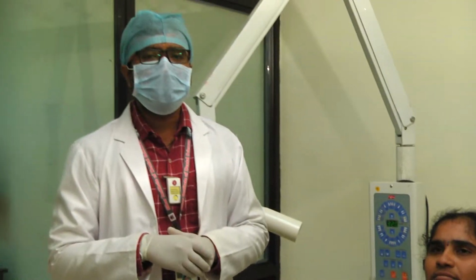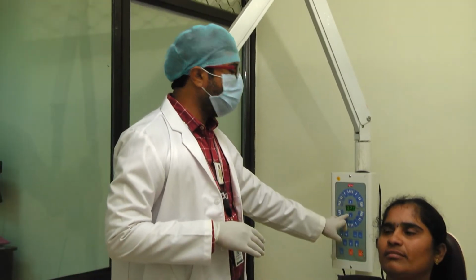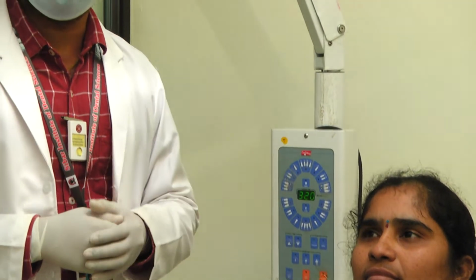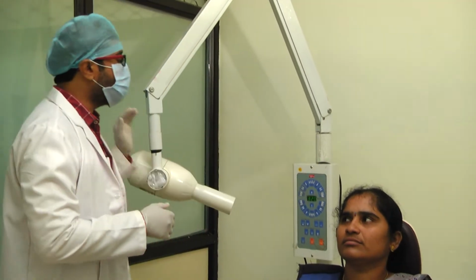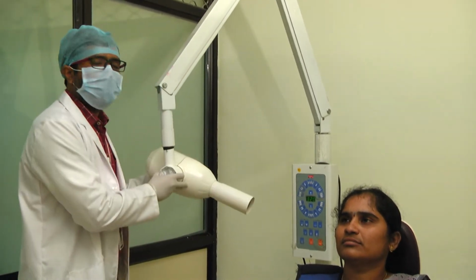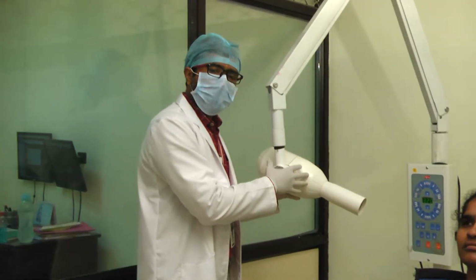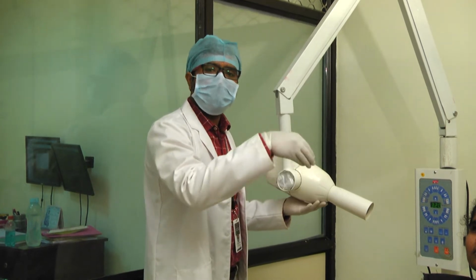The second is to set the X-ray machine settings, that is the kVp, mA and exposure parameters, as per the guidelines and recommendations given by the manufacturer of the film. The third is the position of the tube head. The tube head has to be positioned to the side of the radiograph to be taken, so that it is readily available after the patient placement of the film.